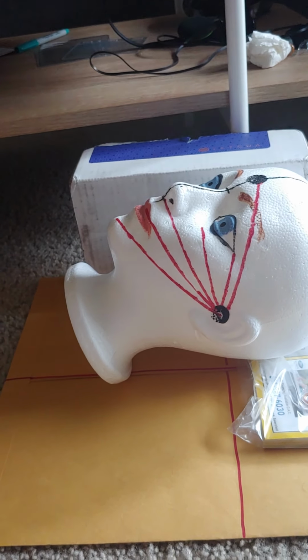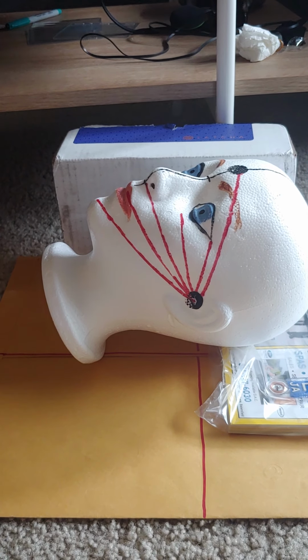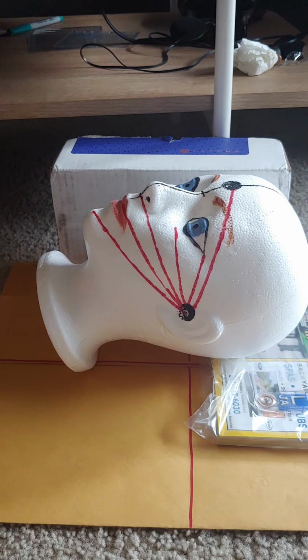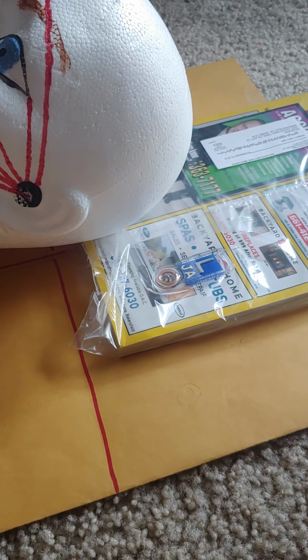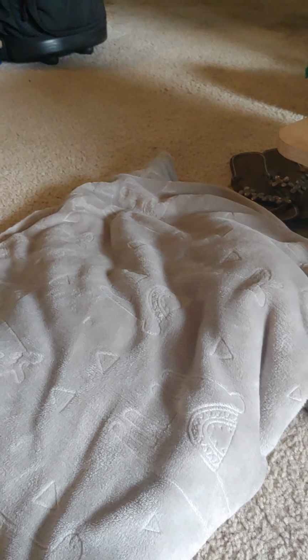For the evaluation criteria for this projection, you want to see the petrous ridges visualized within the orbits. And I have my left marker to indicate that's the patient's left side, and then a shield to show the patient was shielded.